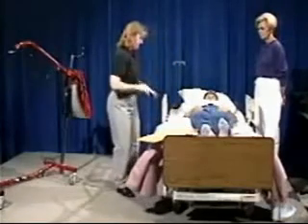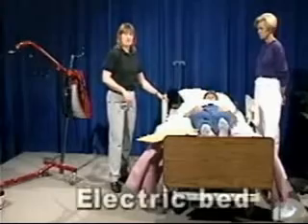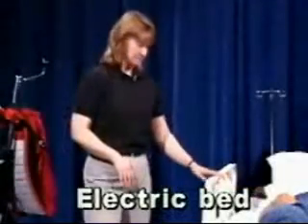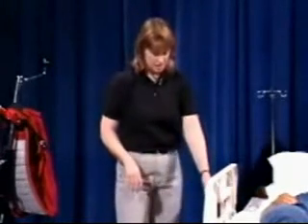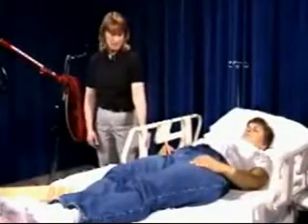Another device, which I guess we could call it a device, is the bed. Sometimes you can use the bed, if it's an electric bed, to your advantage in helping to move or transfer a patient. Many of the beds now in facilities are electric. Keep in mind that you can use the settings on these beds to make your transfer easier. If you need to lower the bed so the patient's feet can reach the ground, you can go ahead and lower the bed down. If you need to raise the bed to even out surfaces between transfer heights, do that.